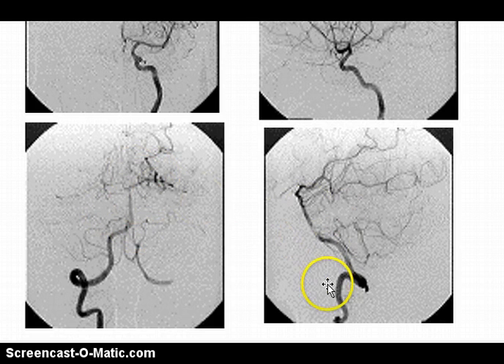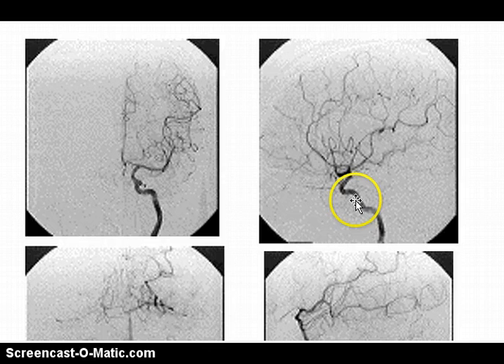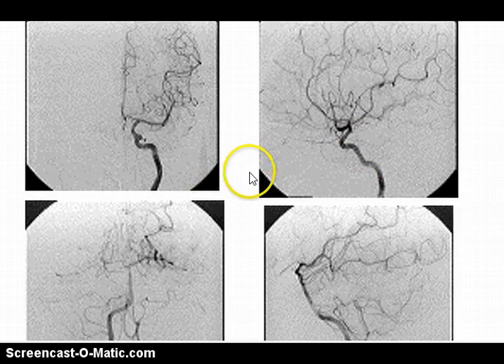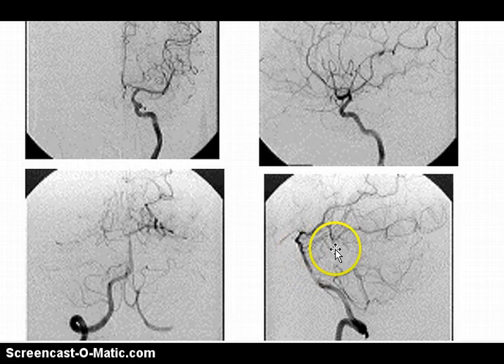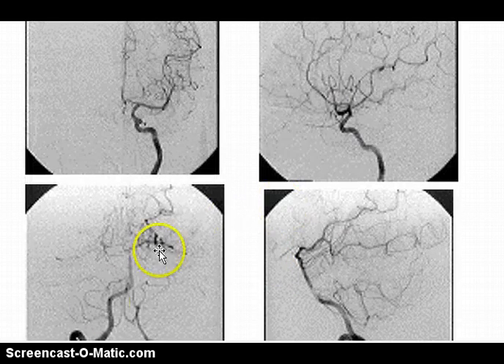And then this is the lateral, and again, you look for this characteristic segment right here, and after that segment, all of the vasculature goes posteriorly to the back of the brain. And this segment is the basilar artery. At first they all look the same, so it just takes practice looking at them and recognizing the characteristic signs to figure out what's what, especially when there are no bony landmarks. That makes it difficult.